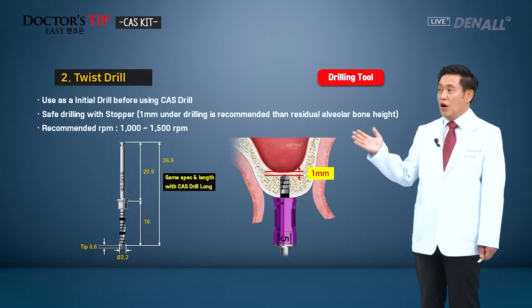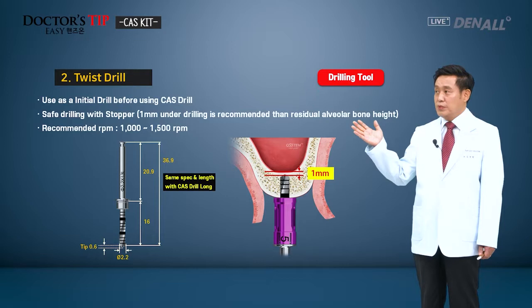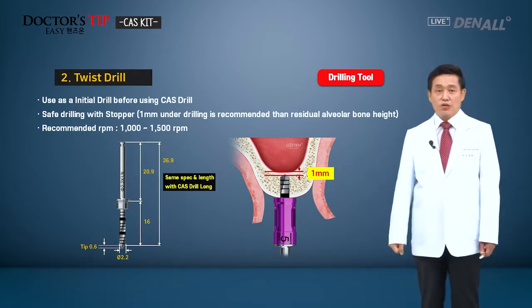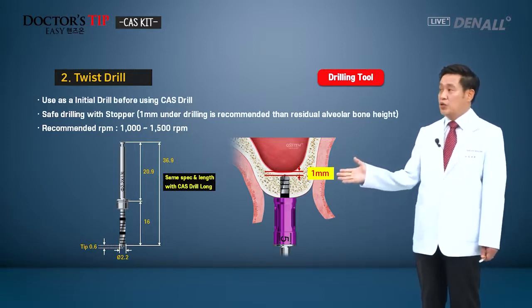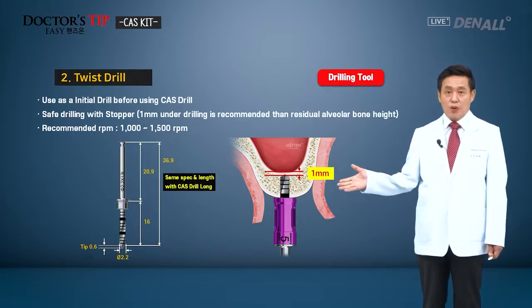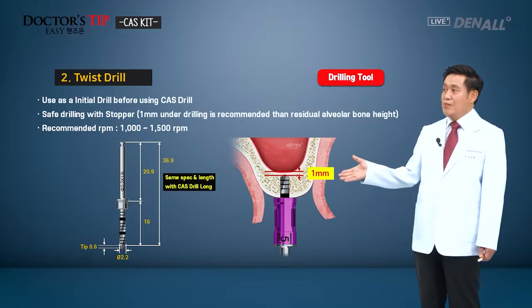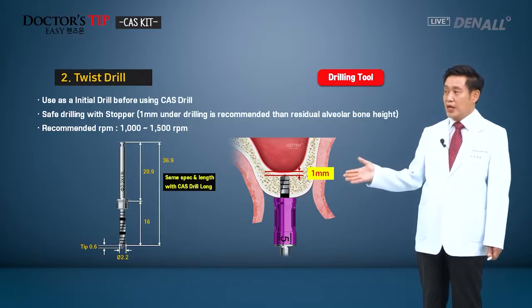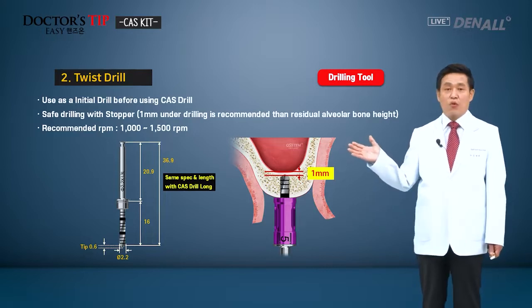Next, the twist drill. After the initial drilling, before using the CAS drill, this can be used. In the case of the twist drill, on the panorama or CT, after evaluating the residual alveolar bone height at the maxillary posterior region, you need to under-drill by 1 millimeter less than the height to be safe. Its specification is the same as the CAS drill, and the stopper can be used to adjust the length of the drill.